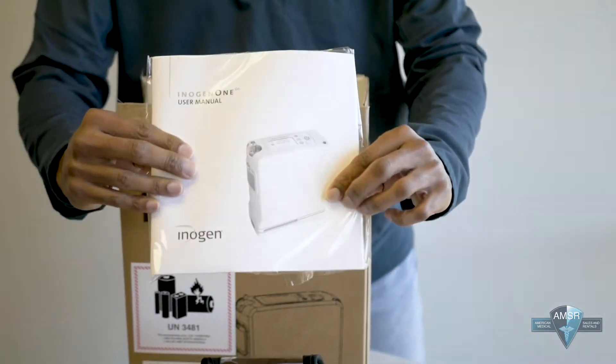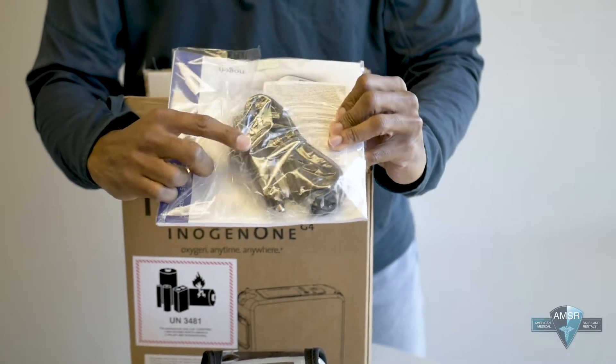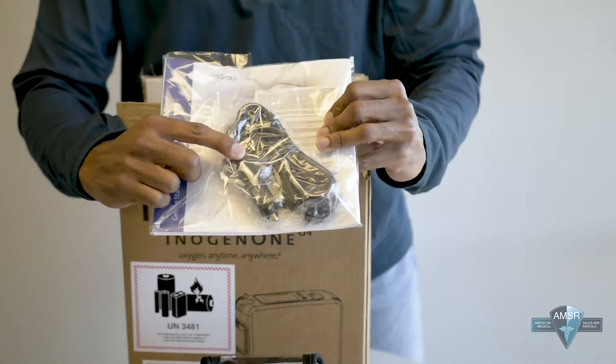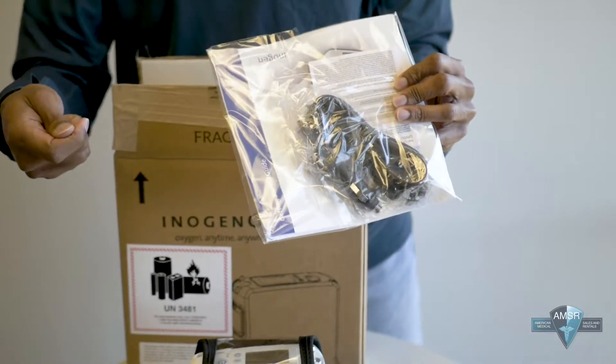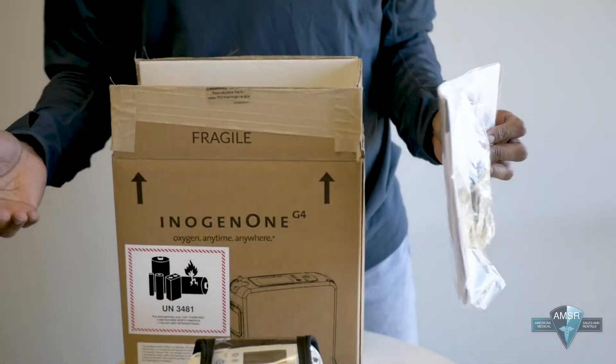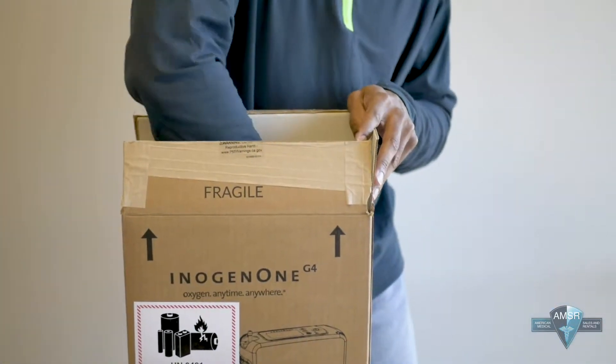Also when you unbox it you get a manual, and in that manual it also has the DC adapter. This is the adapter that you use when you are using this machine in your vehicle. You can plug it into the DC outlet in your car, and when you're using it in the car it charges your battery at the same time.